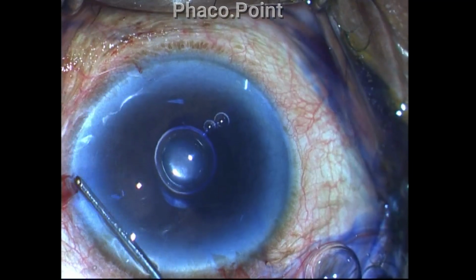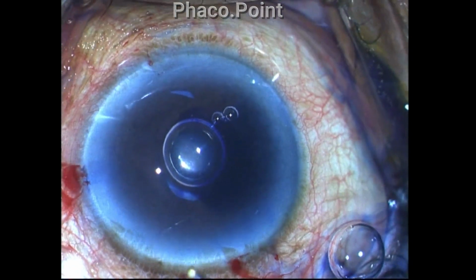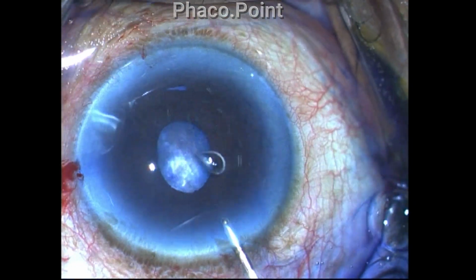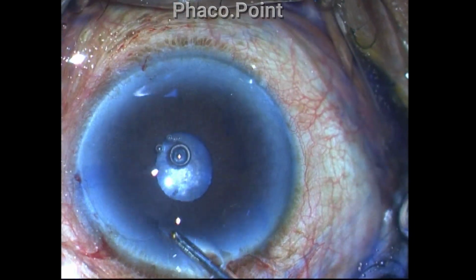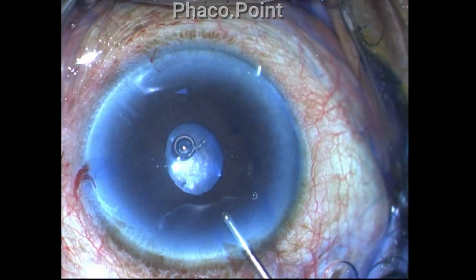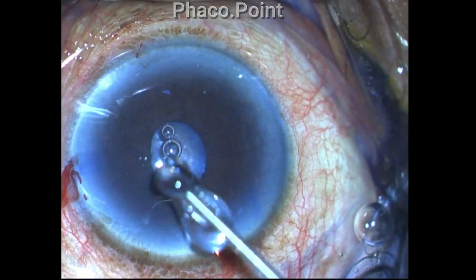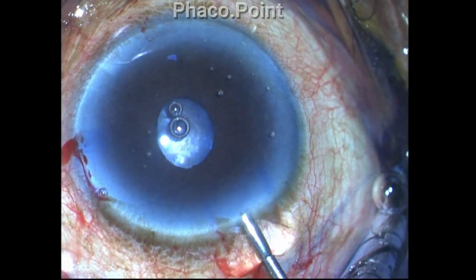The epithelial detachment I did not manage at this point, thinking that I would remove the epithelium if it grows bigger during the course of the surgery. So this is what the plan is: to put in viscoelastic, pupil dilating devices and continue. But while putting viscoelastic, I encountered my first setback.